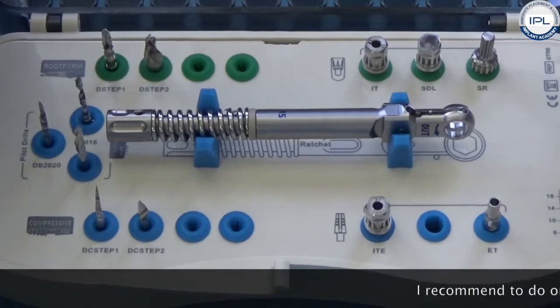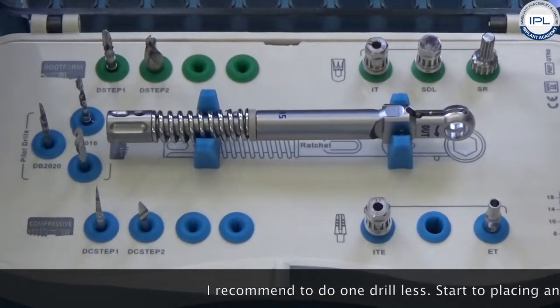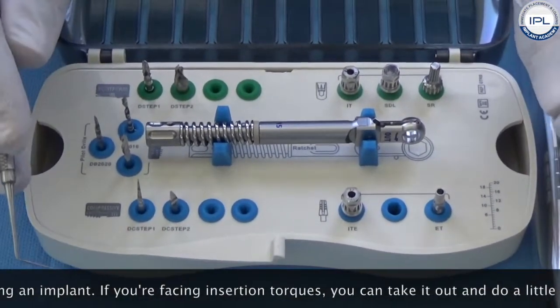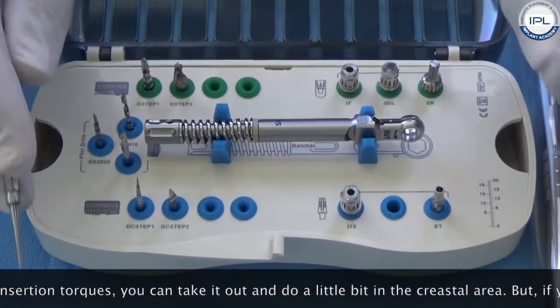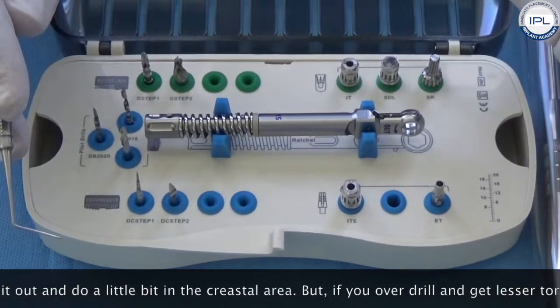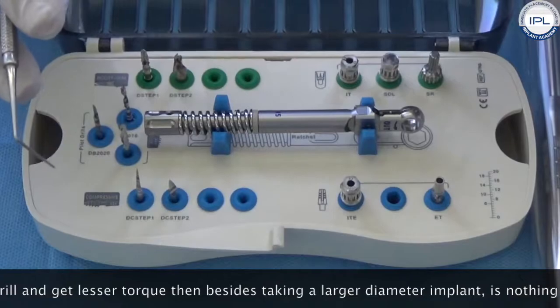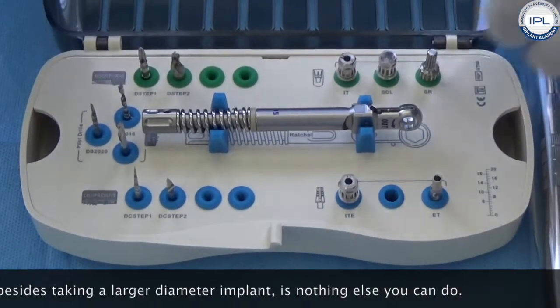My recommendation is always to do one drill diameter less, then start to insert the implant. If you are facing very high insertion torque, you can always take it out and do a little drilling in the crestal area. But if you over-drill and get lesser torque, then besides taking a larger diameter implant, there is nothing else you can do.